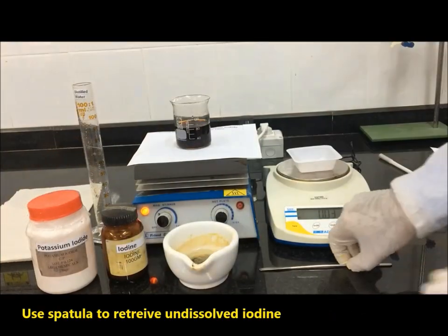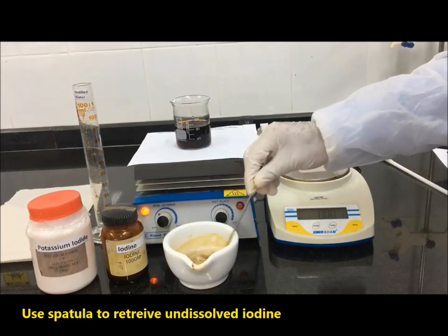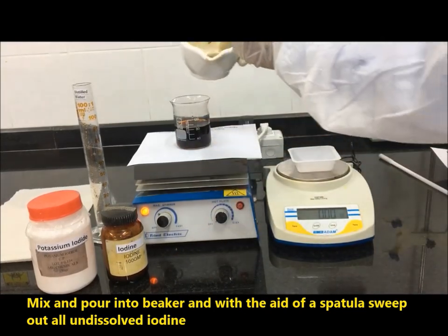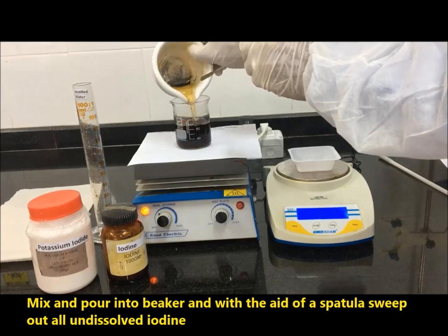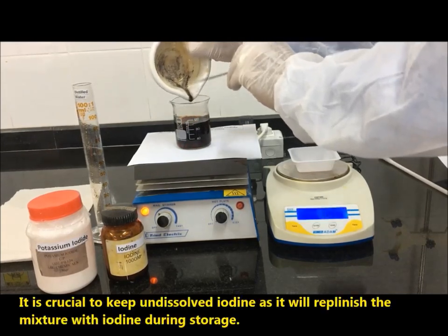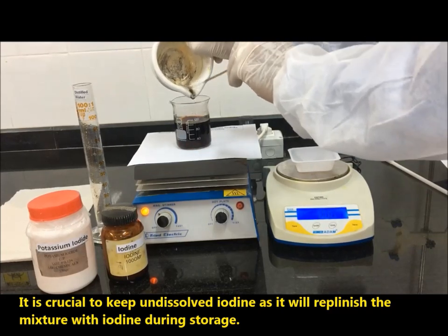Use a spatula to retrieve undissolved iodine. Mix and pour into the beaker, and with the aid of a spatula, sweep out all undissolved iodine. It is crucial to keep the undissolved iodine, as it will replenish the mixture with iodine during storage.